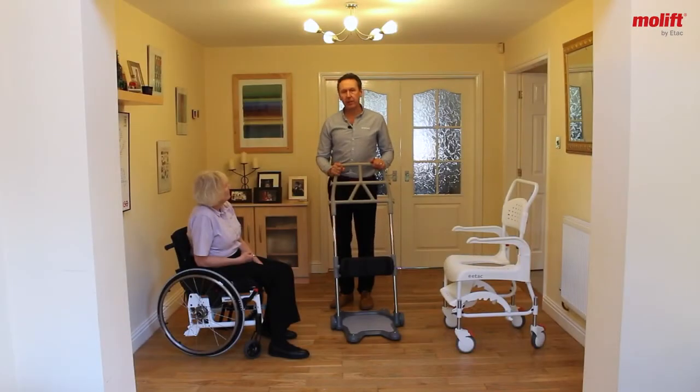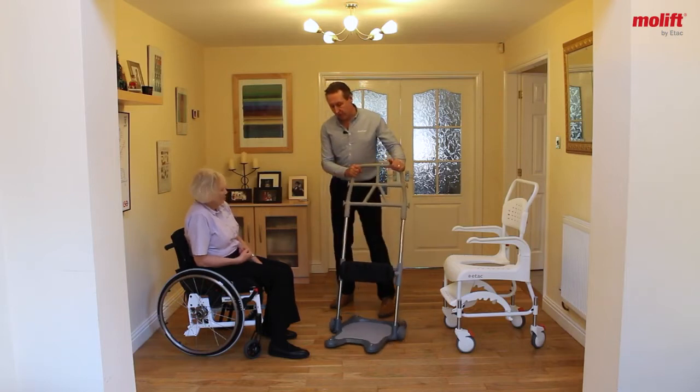In this scenario, we're going to simulate the transfer of a client who's got the use of one arm and one leg following a stroke. So I'm going to bring the MoLift Razor Pro in.